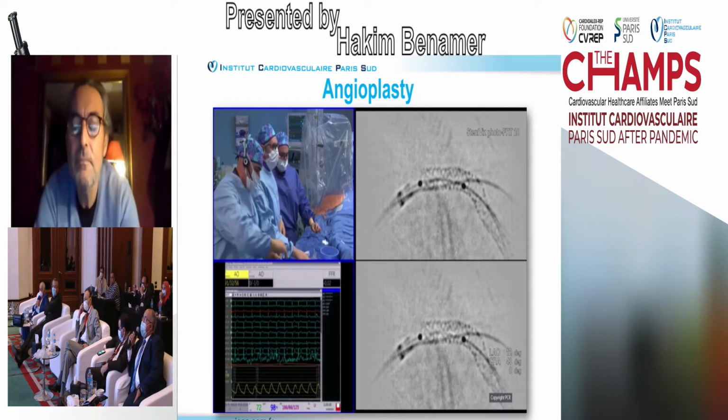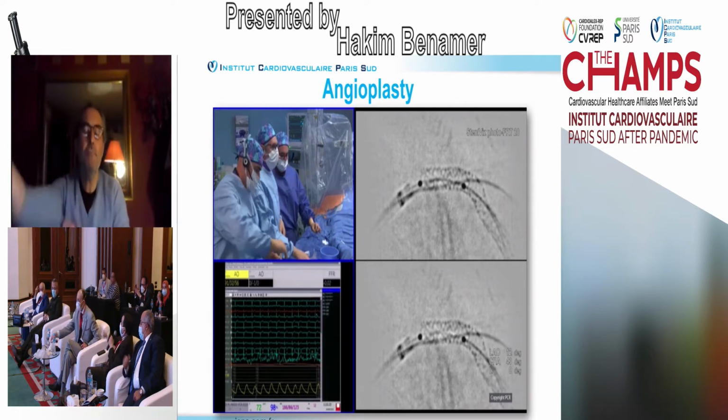I think some of the manufacturers for the 6 French give us the ability to use it, but not all the manufacturers of 6 French regard the inner lumen. So far, I'm not sure what is available in the cath lab. I'd like to choose the 7 French from the start to make more space for doing such complex lesions. So you are with 7 French? Yes. Dr. Muhammad Sadiha? Yeah, I am with both.